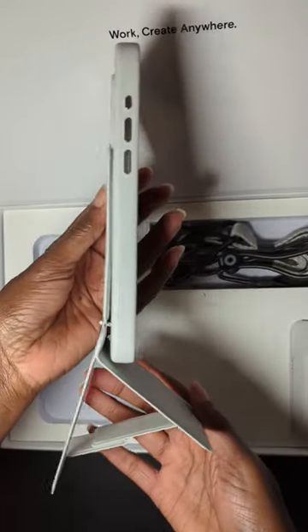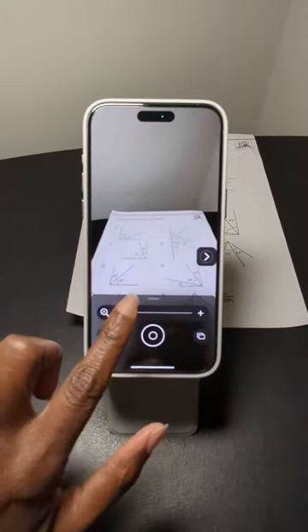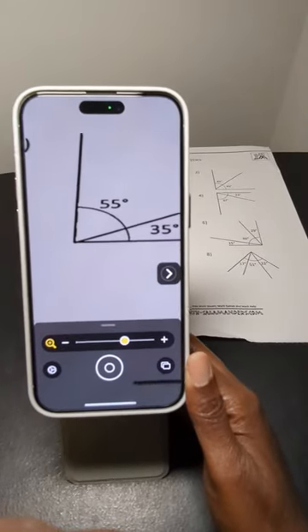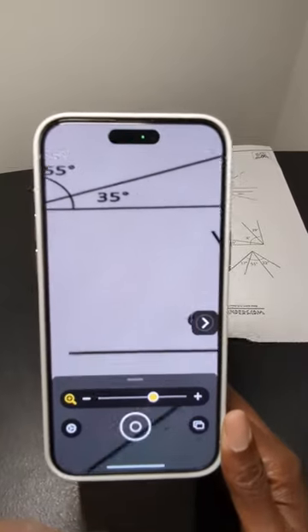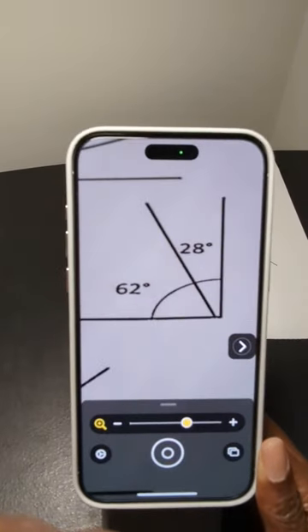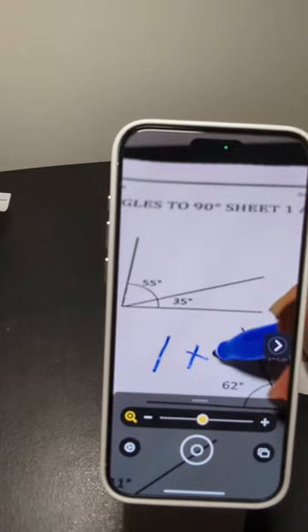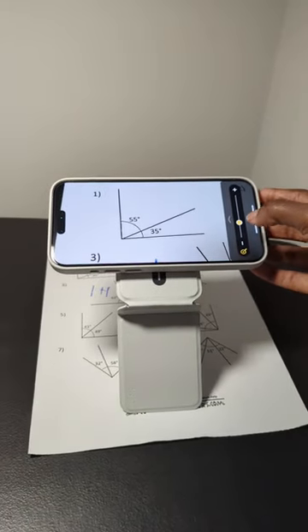Here I am using an iPhone with the magnification app, using it as a CCTV of sorts. I can zoom in using the app, and I can also write on the worksheet and zoom in as large as I want.